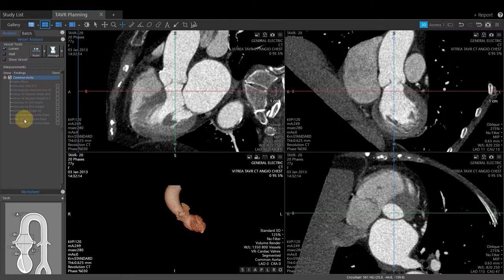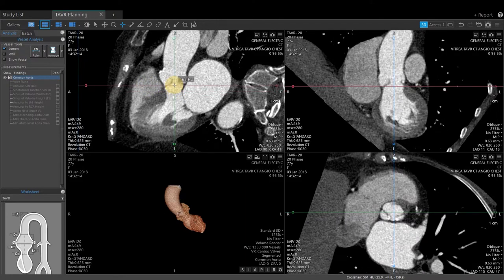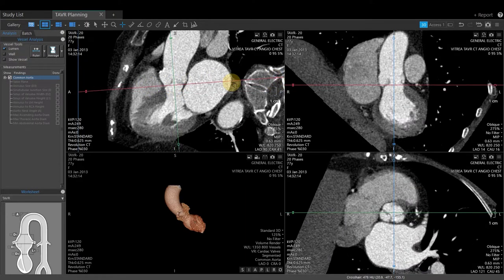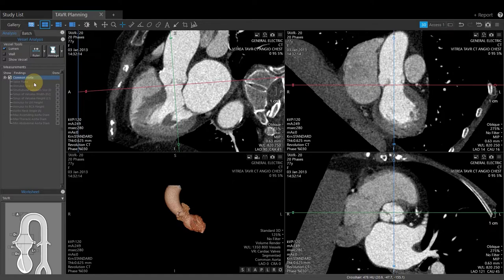Note that prior to clicking any measurements, the active tool is the crosshair with reference lines. One common mistake is wanting to drag the crosshair closer to the valve plane or to oblique. If you do that while active on the common aorta measurement list, as soon as you select valve plane, the images will reset back to where the software set the initial valve plane. Do not drag the crosshair around, because as soon as you click valve plane, it's going to re-oblique you.